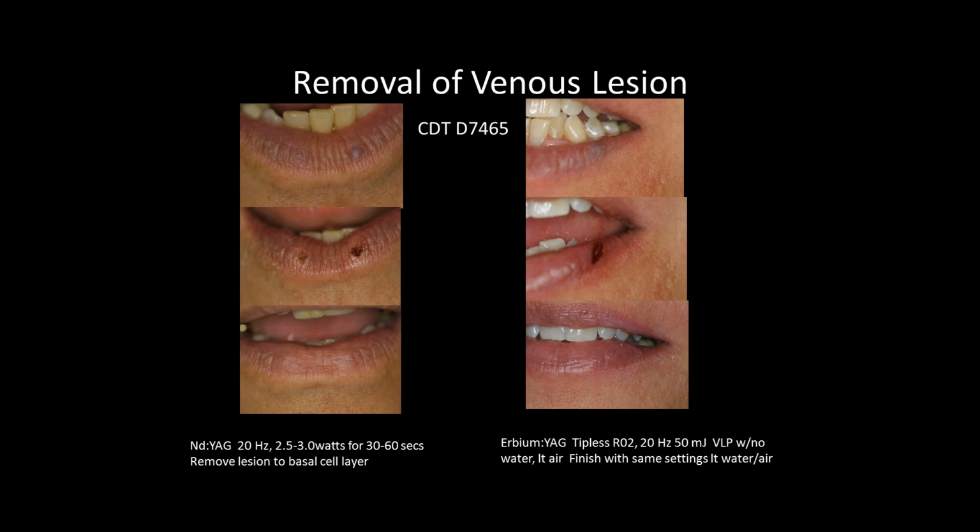So I said the dermatologists aren't doing this. With our lasers, we can do this really easy. You can do it with either the erbium or the ND-YAG. I like using the ND-YAG. It just works better. 20 hertz, 2.5 to 3 watts setting. 30 to 60 seconds treated non-contact on this will shrink that lesion up. Some of the doctors I talk with are using things like a piece of ice over the top of it or a cold slide and shooting it right through there.